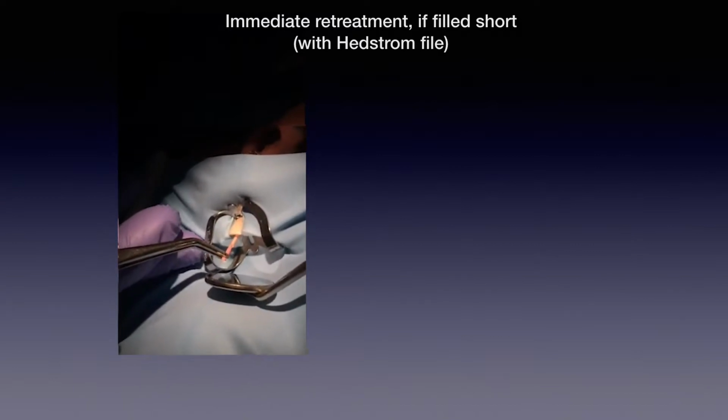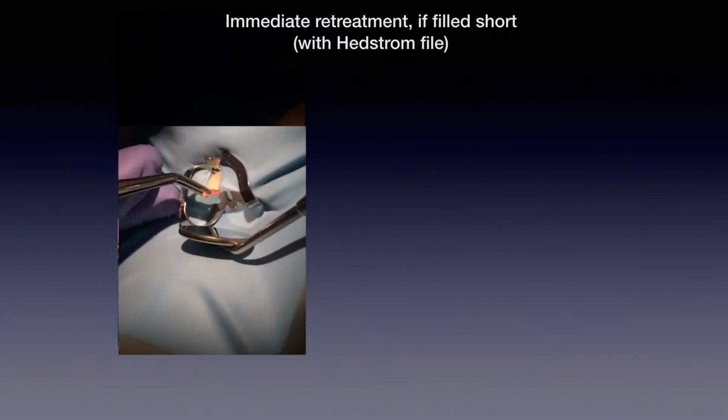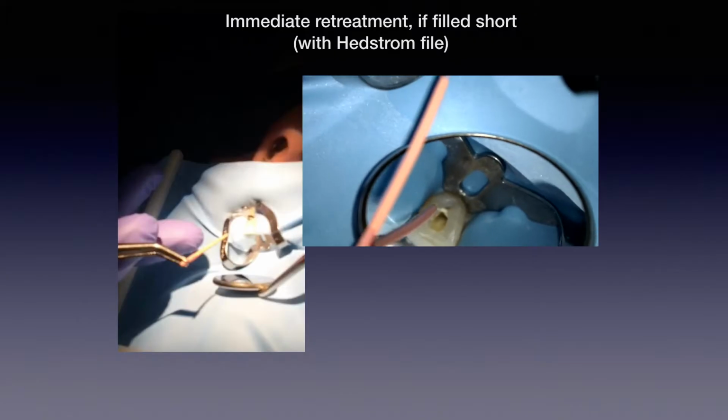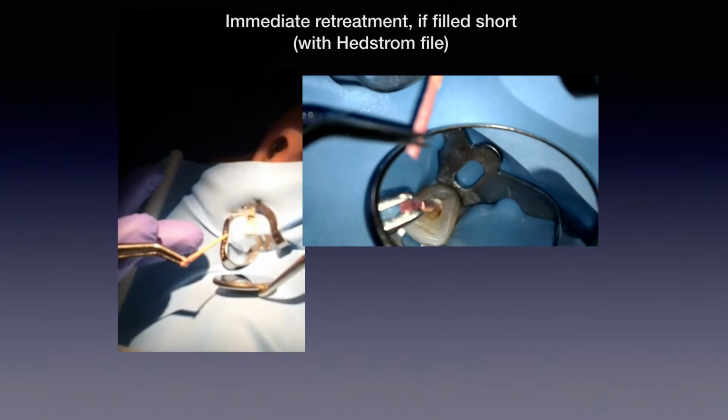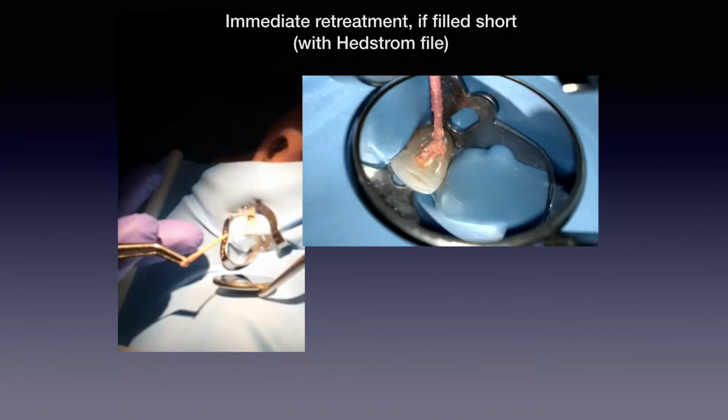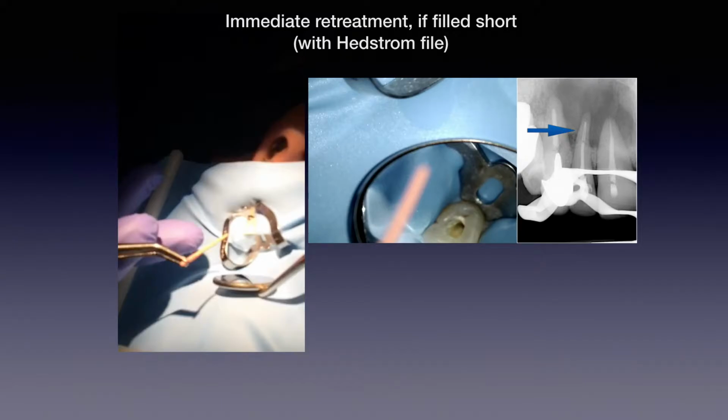So first is immediate retreatments. Imagine you fill a canal short, and I'm going to show you this little video of me putting in this GuttaCore, and for whatever reason, I'm not going to the length that I need to go. Whether I spent too much time from the oven and let it cool off, or maybe, here's my clinical view of the same case, maybe I was too fast, maybe I didn't use the corresponding size of the GuttaCore to the instrumentation, I was way off. Whatever the reason, imagine, as you see in this radiograph, I'm filled way short of the apex.